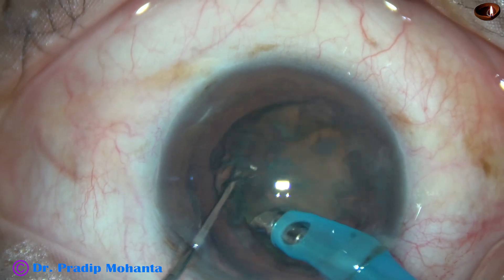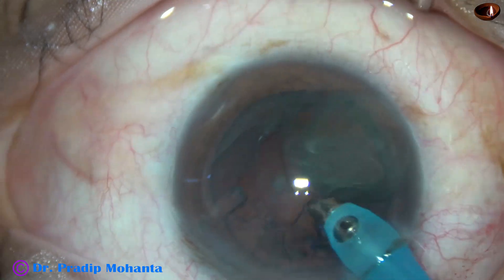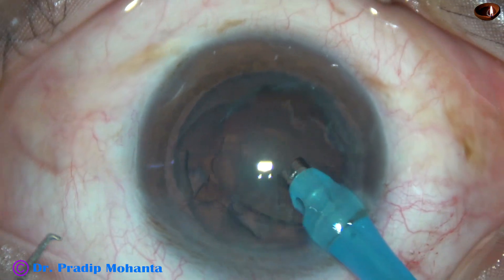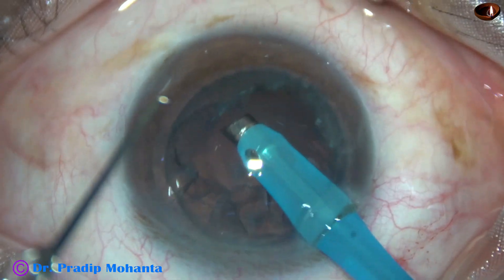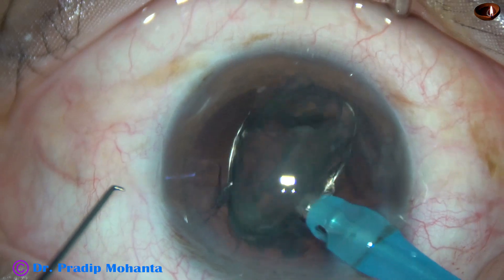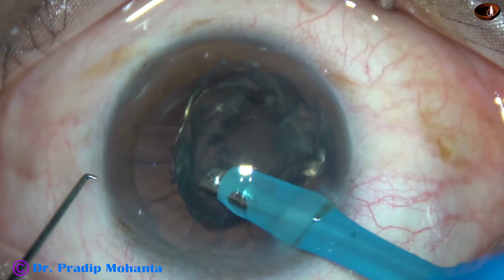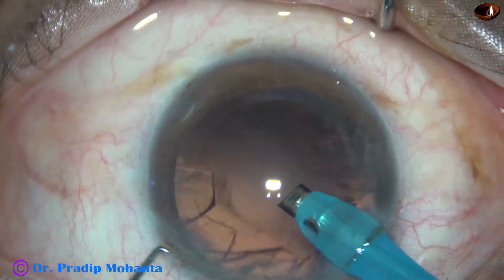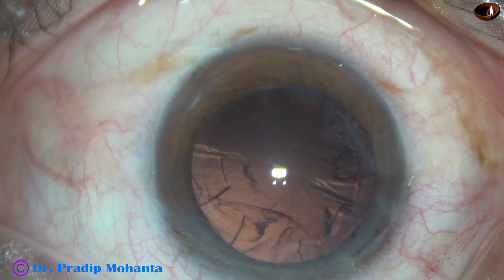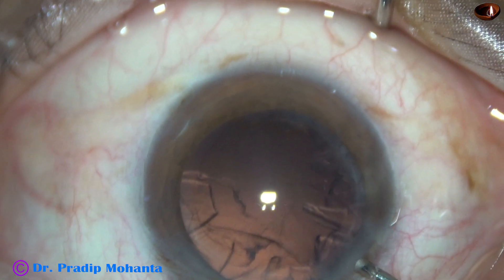Place the teeth at the edge of the nuclear mass, remove the chopper, and carousel the nucleus. It is done. The epinucleus follows. The carousel technique is fast. The prerequisite is that the nucleus should rotate very nicely. Hydro-delineation should be done, and the nucleus should be soft.